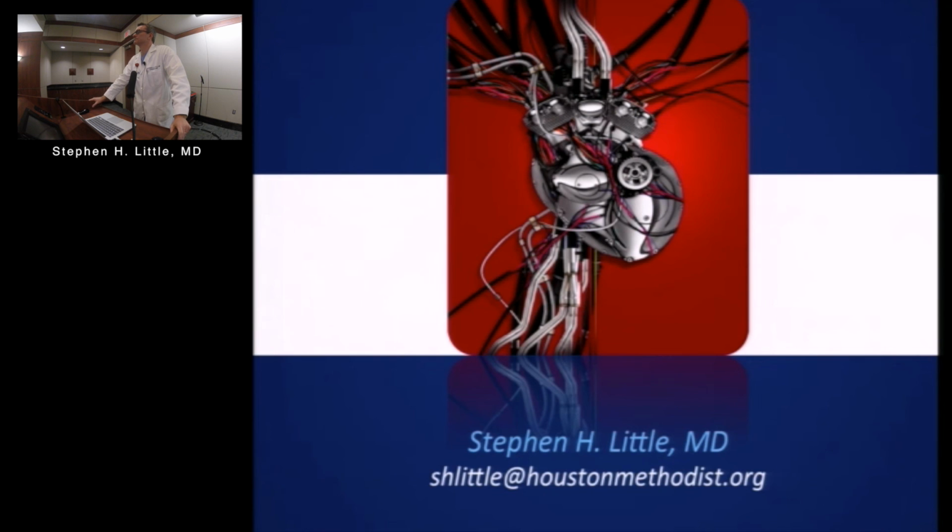Yeah, the valve tension is a big deal, the amount of tethering, the ventricular size and dysfunction is a big factor, and how much of the leaflet you actually get. And one of the challenges with the MitraClip is you have to close both arms at the same time. We've often advocated we need independent closure. You need to be able to grab one leaflet and then pull the catheter over and grab the other leaflet.